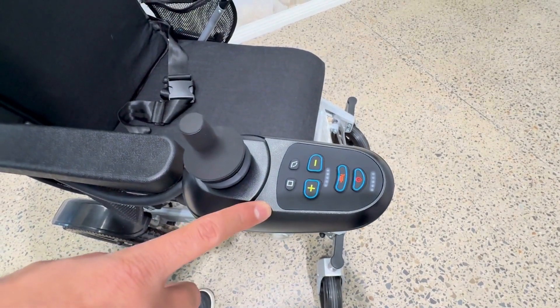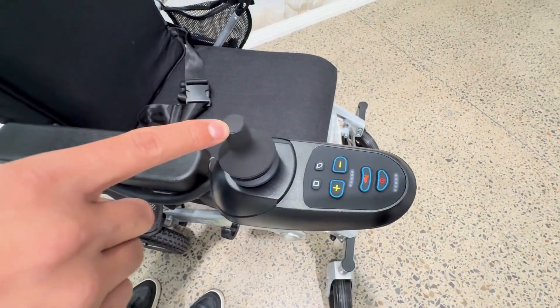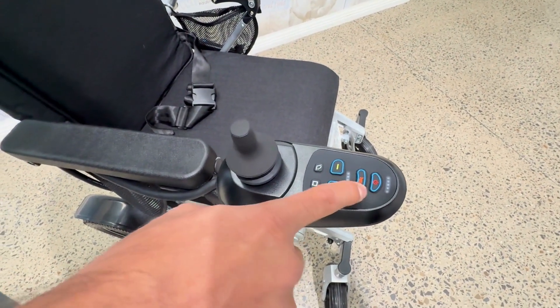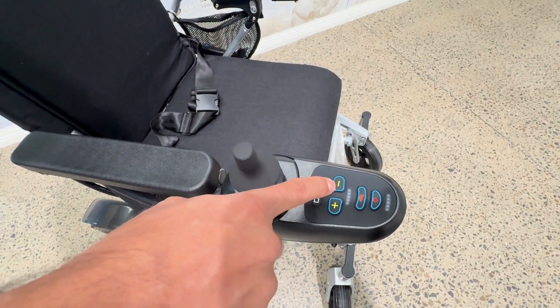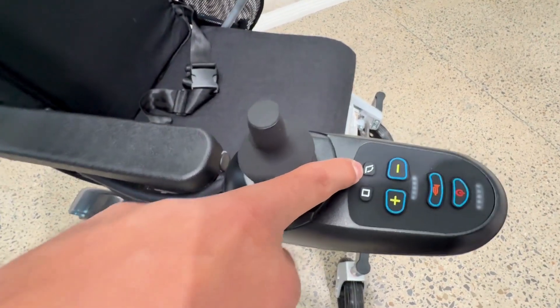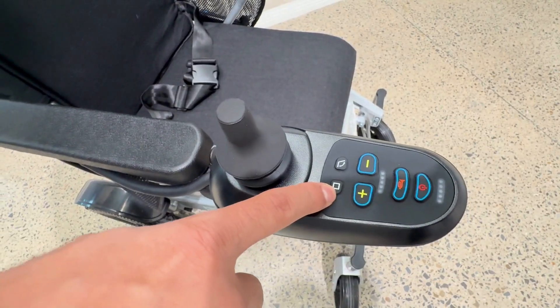Now let's talk about the 360 joystick controller. It comes with six buttons and a 360 joystick controller. This button is used to turn on and off the wheelchair. This button is for the horn. This is used to decrease the speed and this is used to increase the speed. This one is the automatic reclining button and this one is to change the mode from reclining to driving mode.